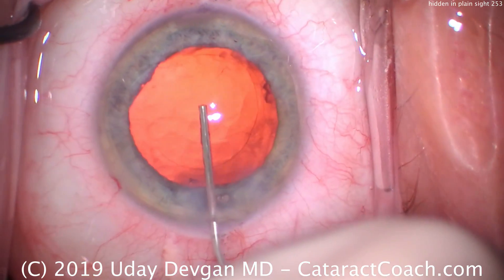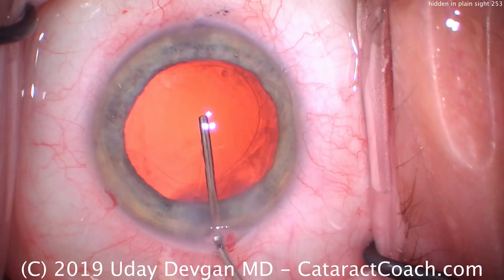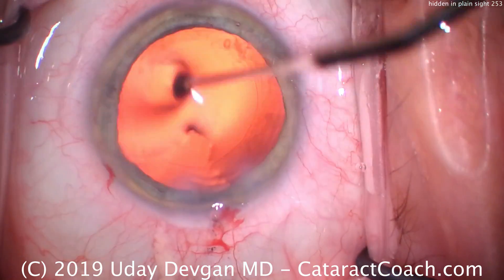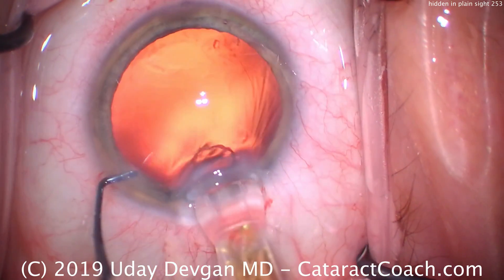Here's the end of the case. Filling our bag with our viscoelastic — that's the cohesive viscoelastic. There's the outline of the rhexis, looks great. And we're going to put our lens in, a single-piece acrylic lens, aiming to place that right in the capsular bag.